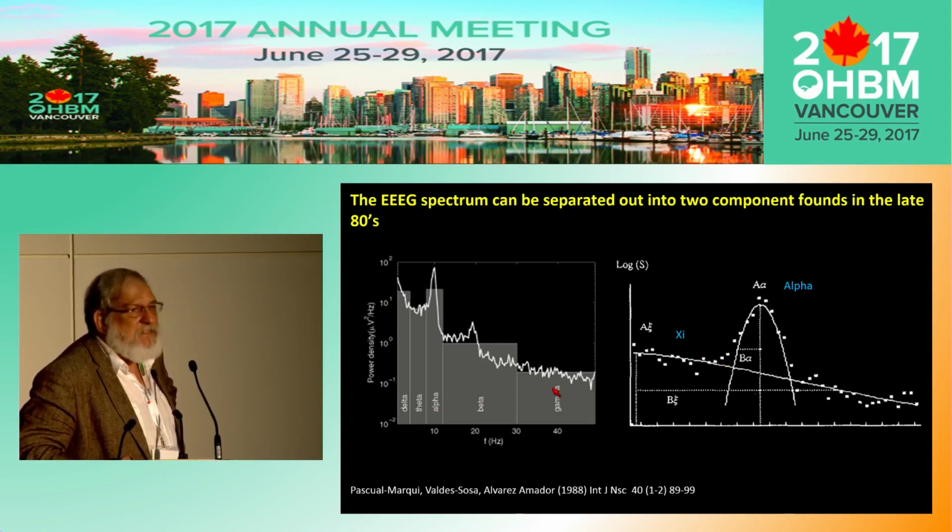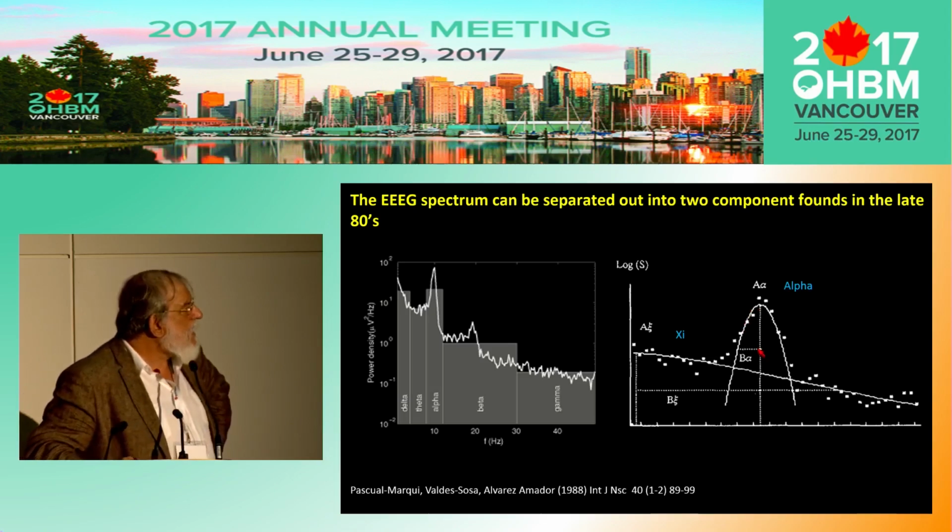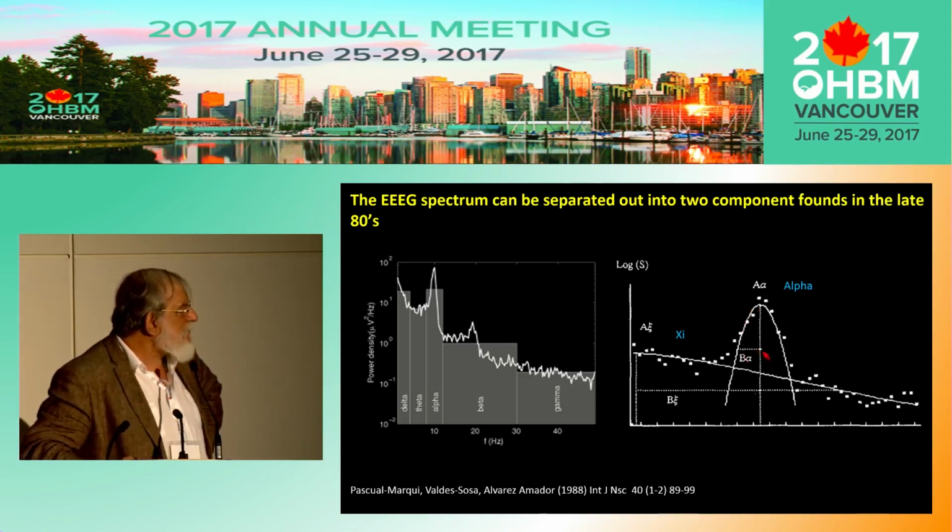And Christoph, maybe this is the reason that some of the results don't hold up, because you have a 1/f activity that cross-cuts all frequency bands. And then you have localized peaks. And it is precisely these localized peaks that are real rhythms, because we have to distinguish between an EEG rhythm and activity in a frequency band.